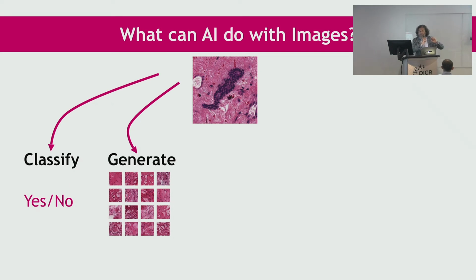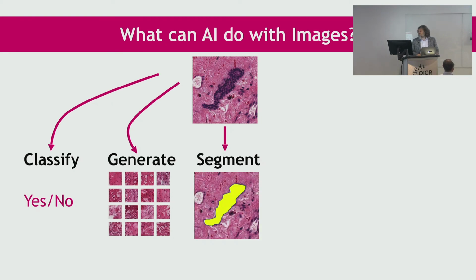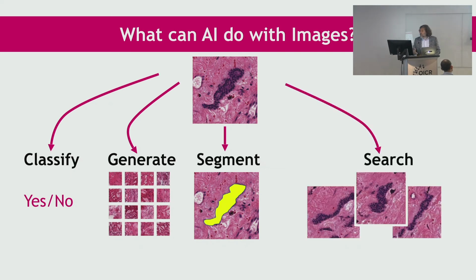They can be just a servant. They are not in charge, they just serve. And generating images is one of them. Of course, segmentation is an old thing, has been around for quite some time, with or without AI. You just look after getting a certain region, a certain tissue type, most of the time cell nuclei, segment them, count them, based on whatever diagnostic need you have. So it's also possible to search within an archive of digital images.